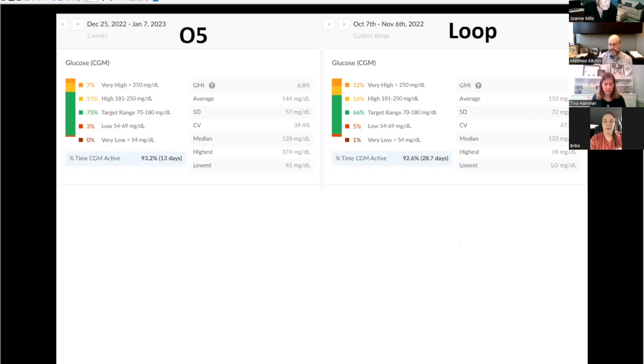I was like, oh, never do that, too high. But if your target's 110 and you're a little more aggressive getting there, you're going to hit down into the 90s and come back up to around 100. So yeah, I understand. I think I had that concern at first, but not at all for me.